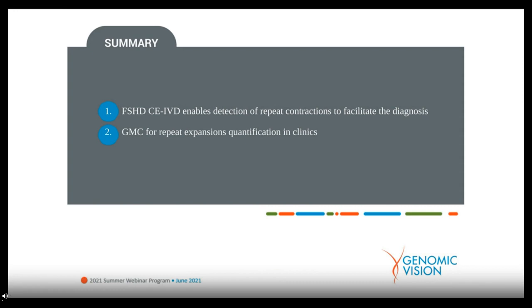But let's start this session. We will go through the use of molecular combing, GMC, and the entire platform to understand some diseases. The first one is FSHD.